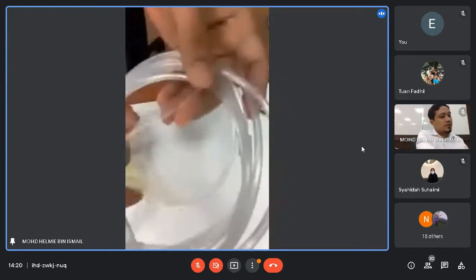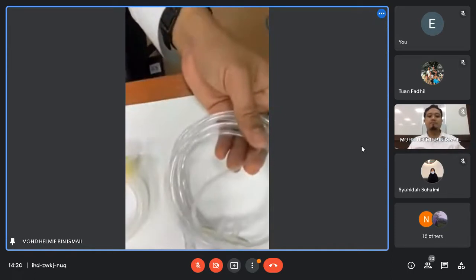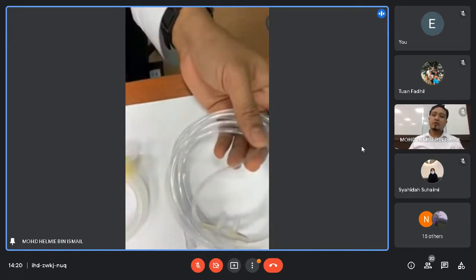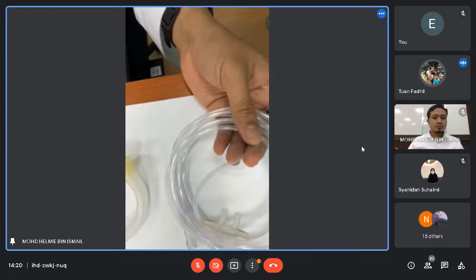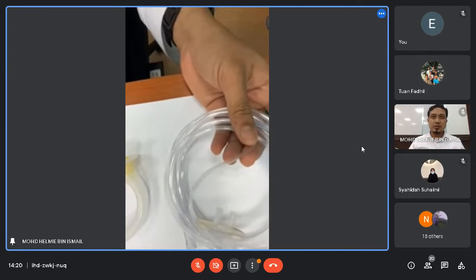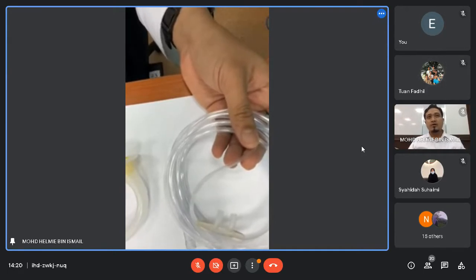Okay, alright. So how much oxygen can you give, FiO2? How much for the nasal prong? What is the maximum FiO2 you can provide with nasal prong? 3 to 5. 3 to 5 liters per minute. Alright, that one is concentration. It's not, that one is flow. How much flow can we give?